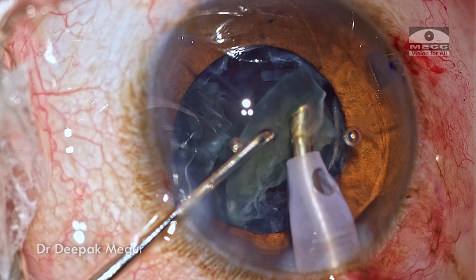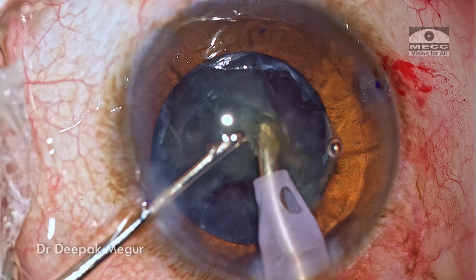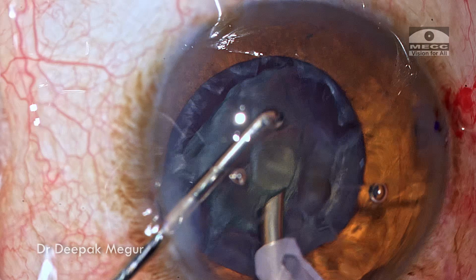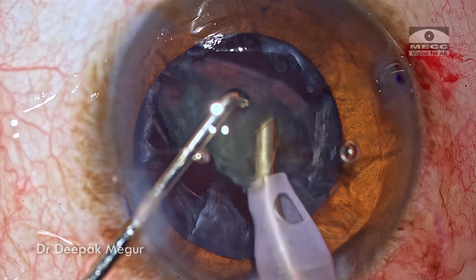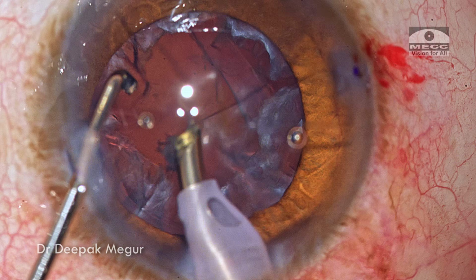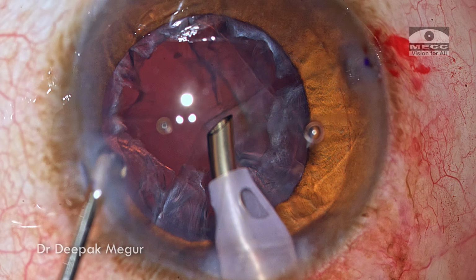Time to emulsify each of these fragments. Again, I'm going to use the torsional energy to do the same. Soft cataracts are a challenge and you need to have the right strategies to deal with them. Dealing with these fragments is easy. Getting the initial chop and pulling them out of the bag can be tricky sometimes.